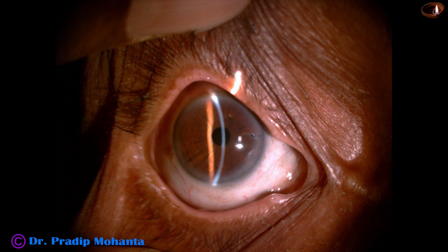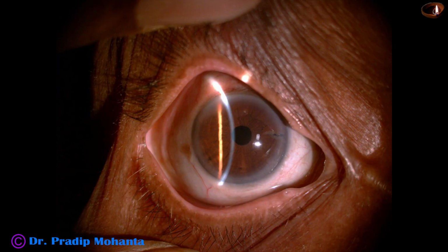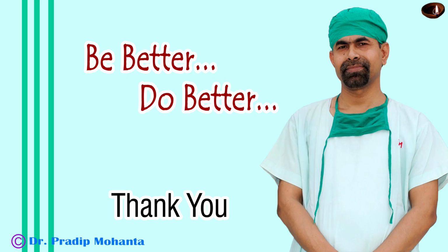Here are some post-op pictures. Cornea is clear, anterior chamber is quiet, pupil is round, unaided vision is 6/18, intraocular pressure is 14 millimeter of mercury. A very satisfactory result. So if we manage posterior capsular rent nicely, we can get a very good outcome.